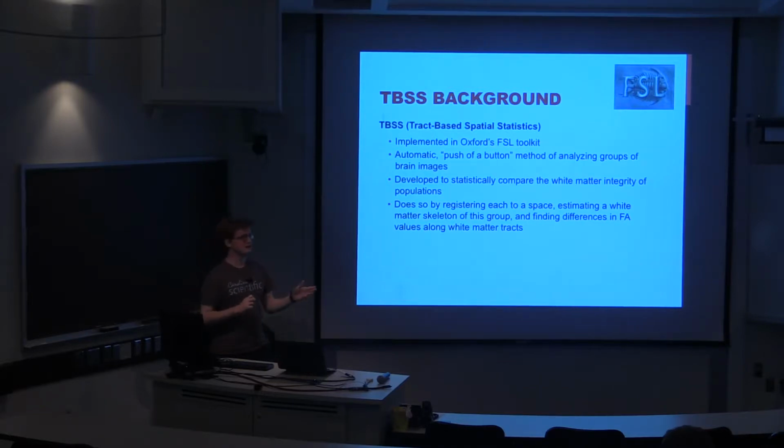And then we can assess from that, that it is suggestive that any one of these disorders affects white matter in that particular area. It's very useful because it's kind of an automatic, push-of-a-button thing. It's very easy to use by neurologists and psychiatrists who would be performing these studies. That's one of the reasons it's very widely used, and it's gotten very popular since it was released about 10 years ago.